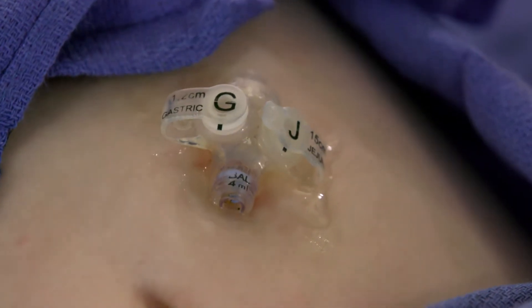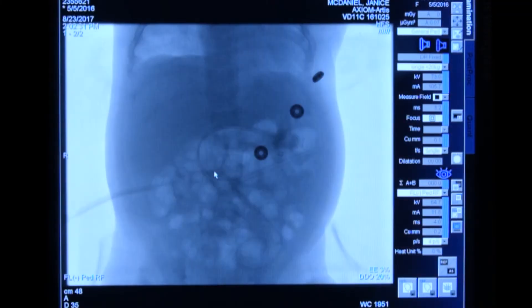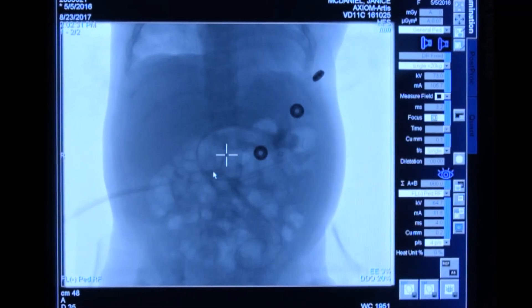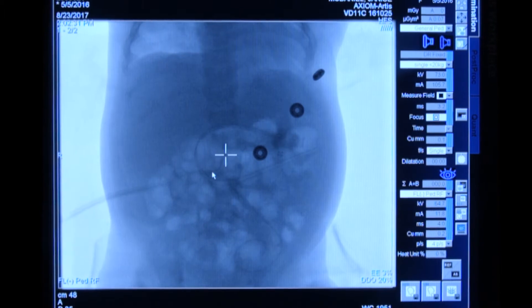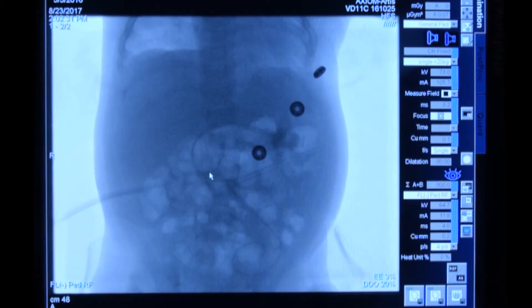For an exchange procedure, the gastrojejunostomy tube is usually already in place. That's kind of a placeholder for us, so what I would do is initially step on fluoroscopy and get an image to make sure it looks like it's still in a good position. If I have a question, I will inject contrast through that tube just to see where it's at.